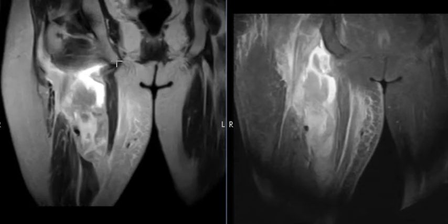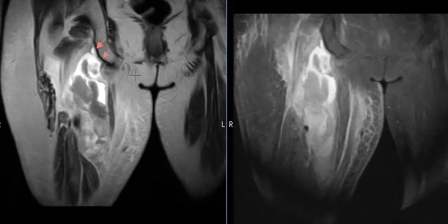This is the ischium, comes down here. This is the left ischium, called the ischial tuberosity, where it pokes out here. This is the left hamstring tendon, one of the three tendons that attach here along this bottom margin on the left, which looks normal. On the right-hand side, though, if I can find my arrows, doesn't look quite normal.